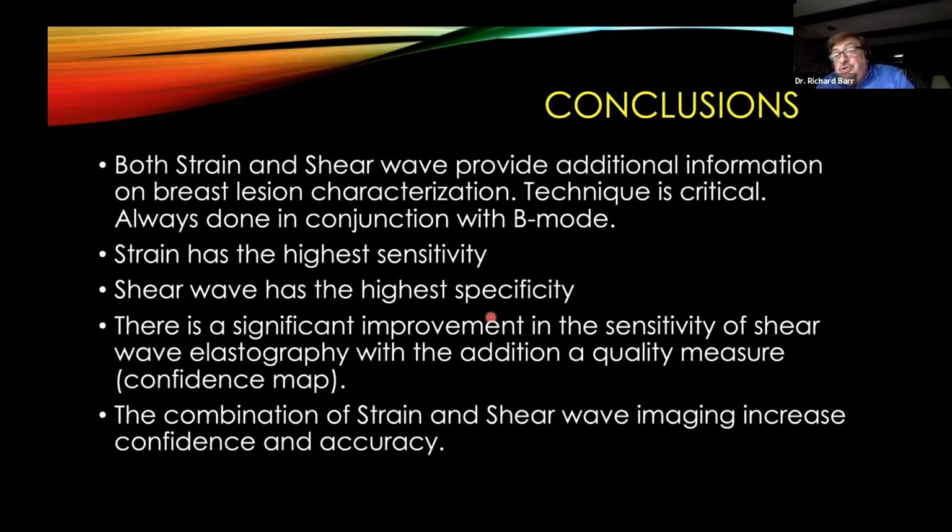So we usually do not use elastography to characterize focal liver lesions. We use ultrasound contrast, and I know it's approved in Brazil. I don't know how many people are using it, but we find that to be much more helpful than elastography for focal liver lesions.